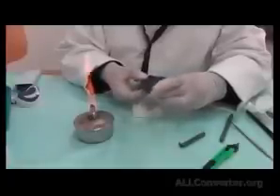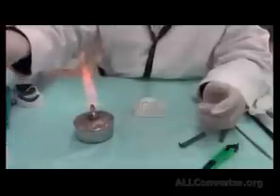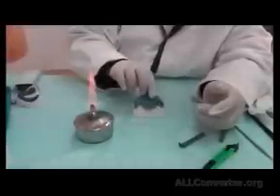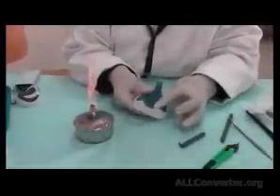I remove the folds and the creases in the material. It's ready to be put in the patient's mouth. I add to it the final shine. I put it in warm water, and then I press it into place inside the patient's mouth. The patient, I would ask him to open maximally.